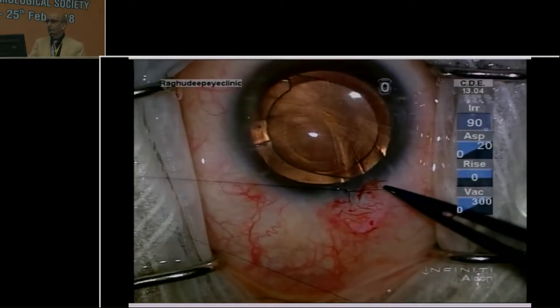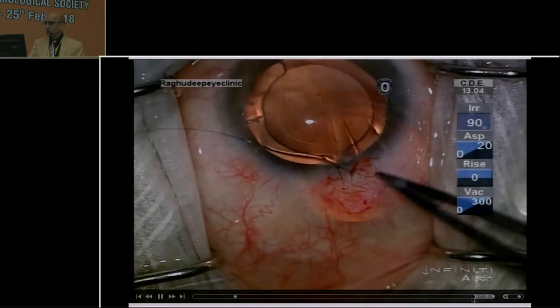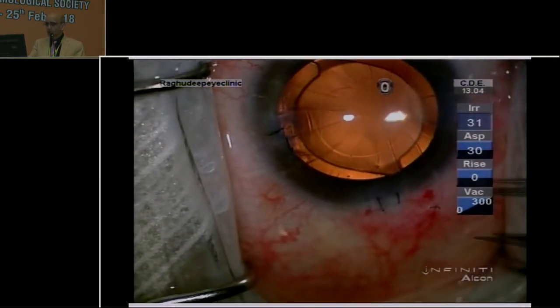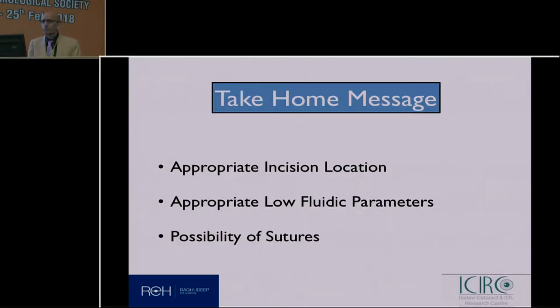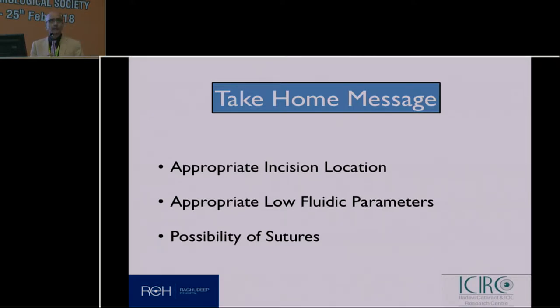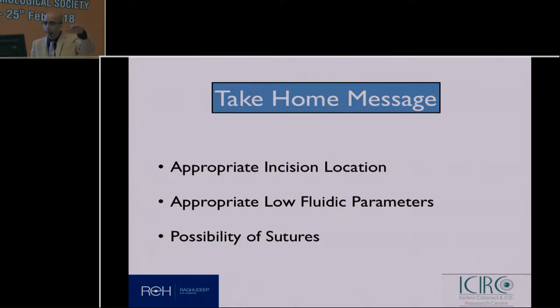These are the typical results. Be prepared to place sutures if you have to. From a surgical standpoint, plan it well — good strategy and good technique in general, but particularly locate the incision carefully. Be prepared to look at the end of surgery and address that. Always employ a slow-motion technique, as Dr. Osher and many others have propagated — this means not only flow rate and vacuum, but bottle height as well.